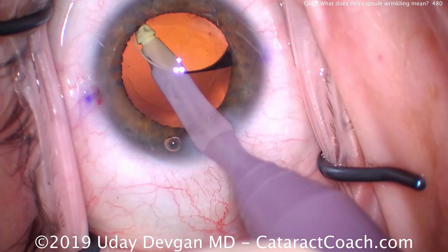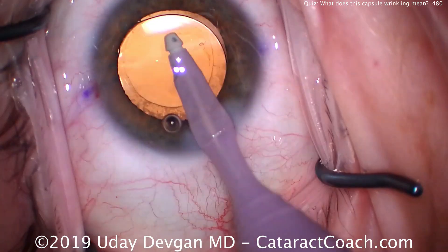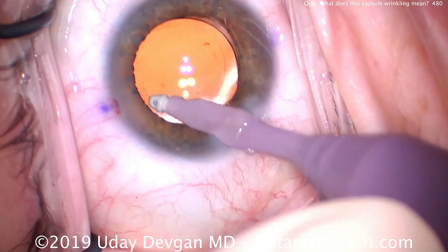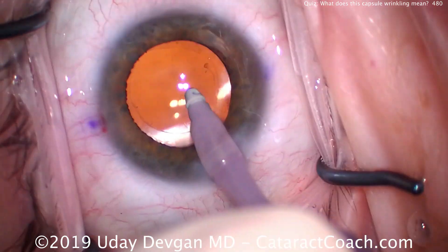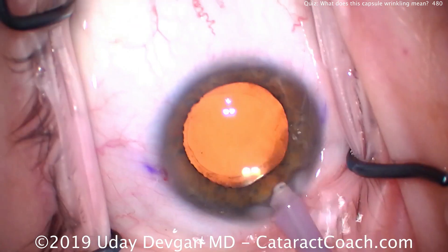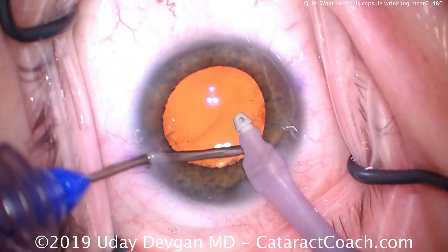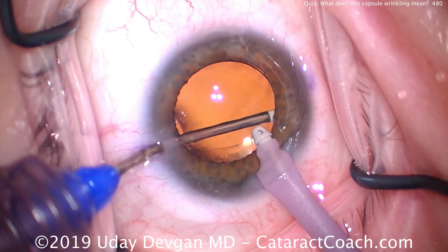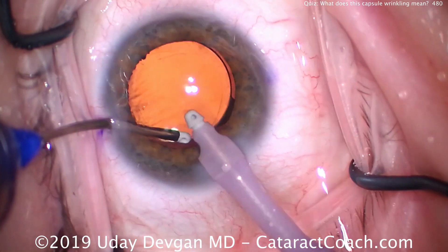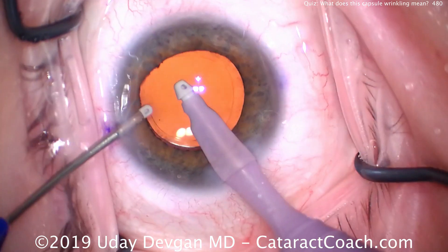Because we're worried about capsule contraction in this case, we're going to do an extra thorough cleanup of the anterior capsular rim. Another important issue is monitoring the patient post-operatively: patients with retinitis pigmentosa tend to get a higher rate of CME — cystoid macular edema — so keeping the patient on anti-inflammatory medications like steroids and non-steroidal anti-inflammatories is important in the post-op period. With these patients you don't want to put in a multifocal or trifocal lens; stick with a monofocal lens to maximize contrast and light delivery to the macula.